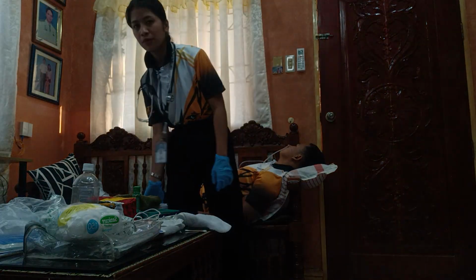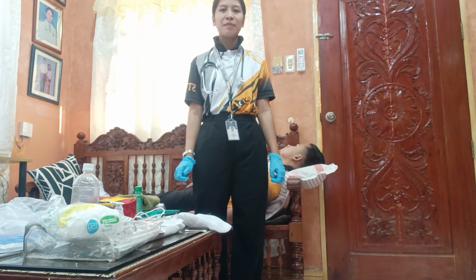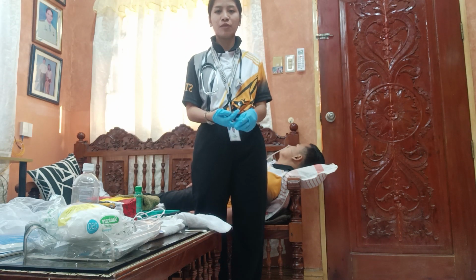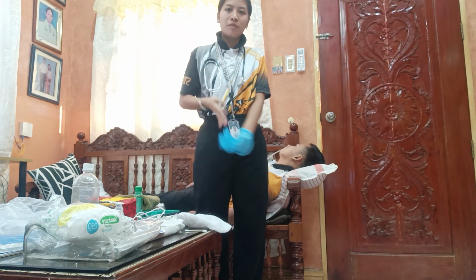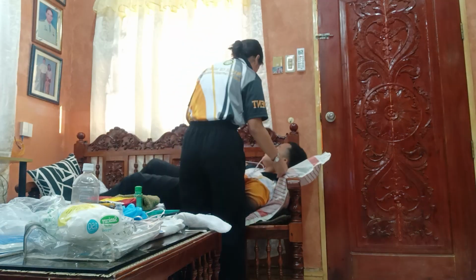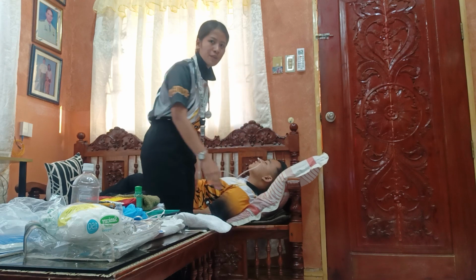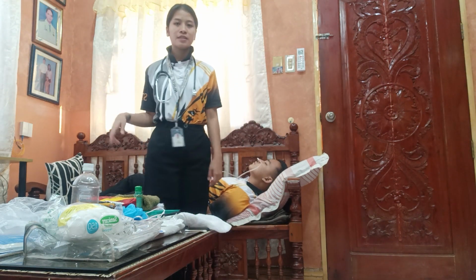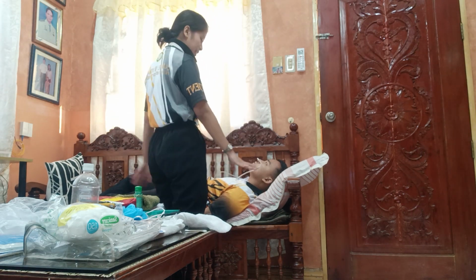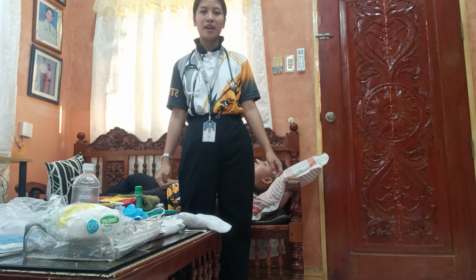So, ito po, remove na po natin lahat ng mga items. And after po nun is, remove po na po itong gloves ko. Pagtapos po mag-remove po is, ipapabalik po natin si patient in comfort position. Okay lang po ba, sir? Okay lang po. And after po nun is raise the side rail and lower the bed. Okay? And after that is remove the additional PPE if used, and perform hand hygiene.